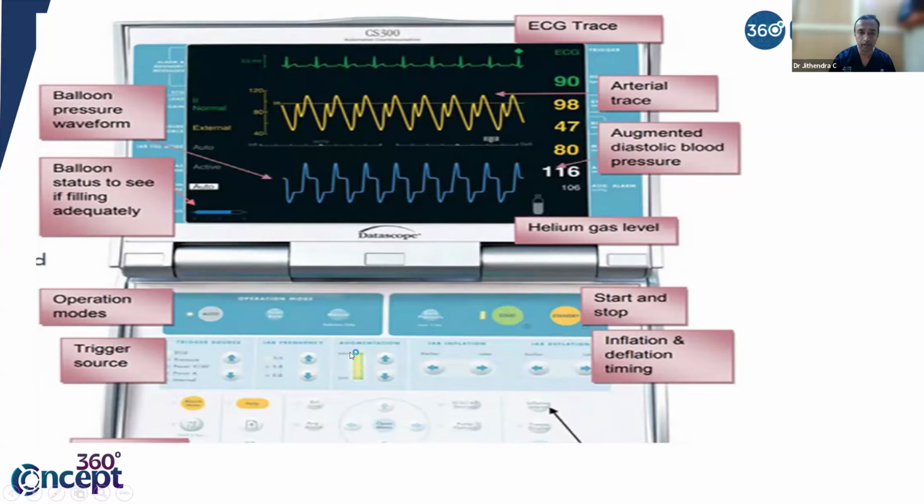And this is your augmentation. Here all the LEDs are glowing, so that means there's 100% augmentation. The ratio for your augmentation is 1:1, 1:2, 1:3. That is also commonly asked from the picture. No need to get frightened when they say it is a question on IABP. Sometimes they keep it very simple. They may not ask you about the timing or to interpret your waveform. They may just ask, what is the augmentation in this particular picture? So what is augmentation? Anybody wants to tell?